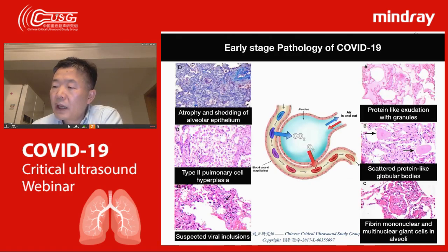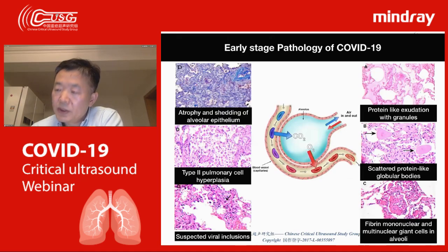The patient has an 8-year history of hypertension and no other underlying disease, and the cardiac function is very good. During this condition, the patient went back to Shenzhen, after that had a very high temperature and developed severe ARDS. So the doctors decided to transplant the lung of the patient.